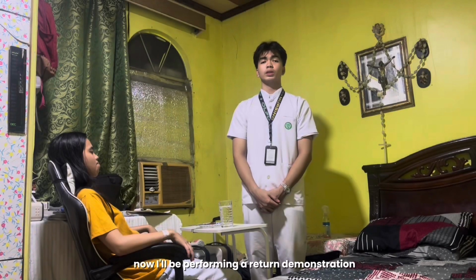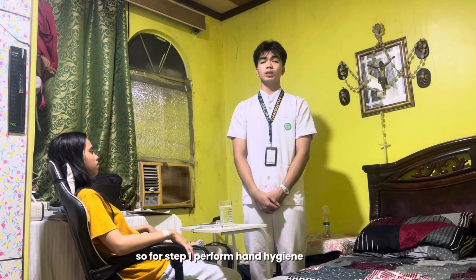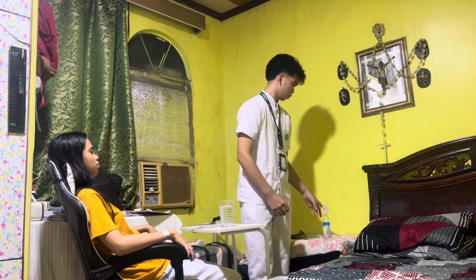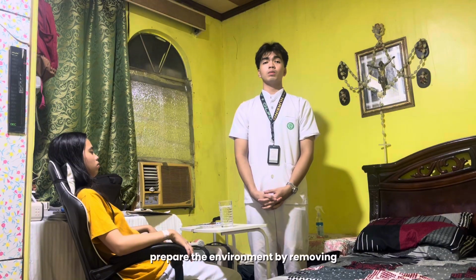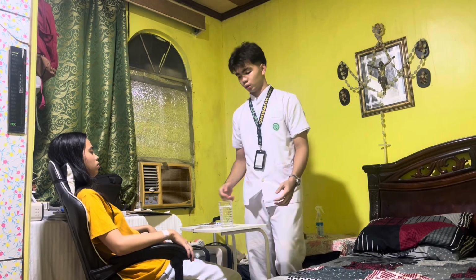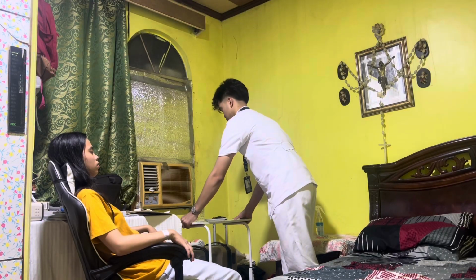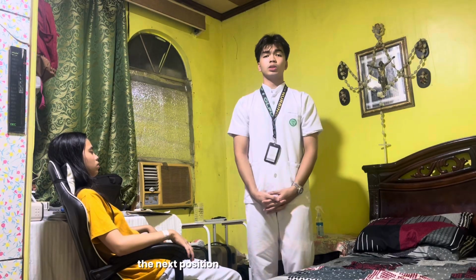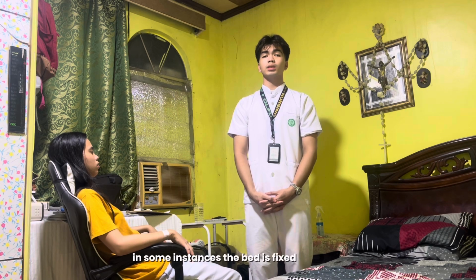Now, I'll be performing a return demonstration for transferring patient from chair to bed. So for step 1, perform hand hygiene and wear PPE as needed. And after that, prepare the environment by removing obstacles and ensuring privacy. Then next, position the bed to its lowest height, ensure the brakes are locked, and slightly raise the head of the bed. However, in some instances, the bed is fixed and cannot be adjustable.